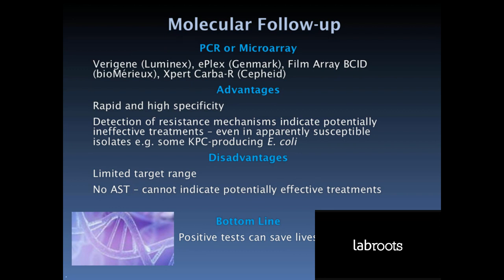The bottom line with molecular tests of positive blood cultures is that they are definitely worth doing, as positive results can save lives.